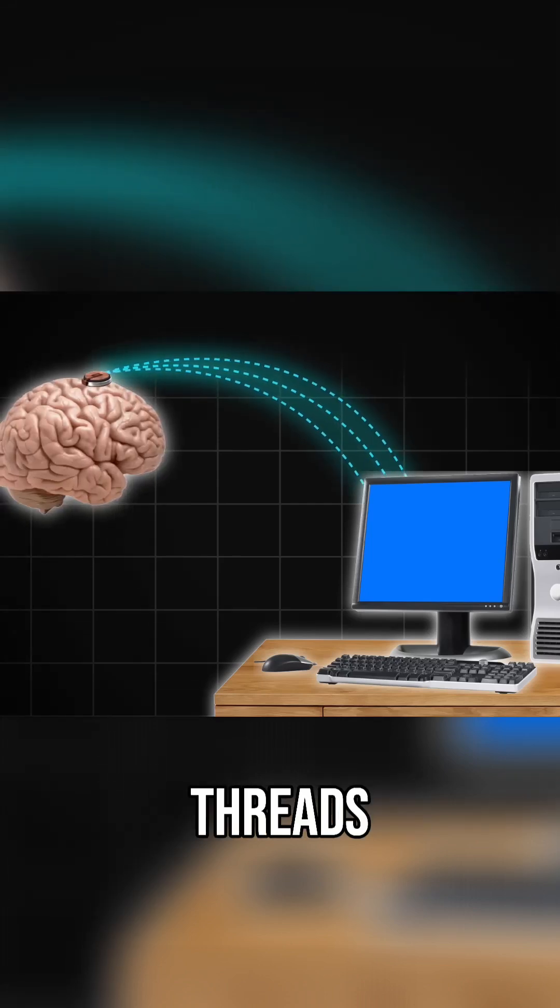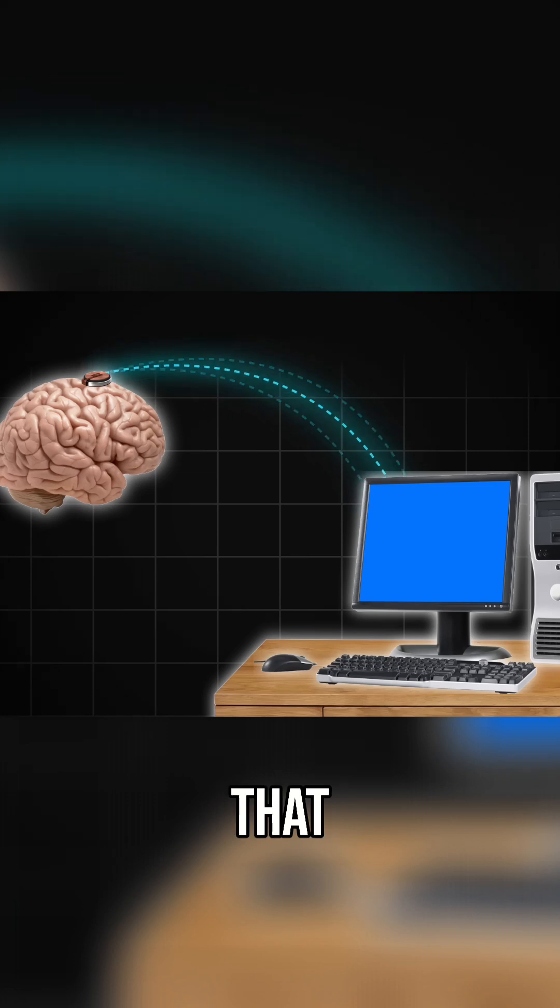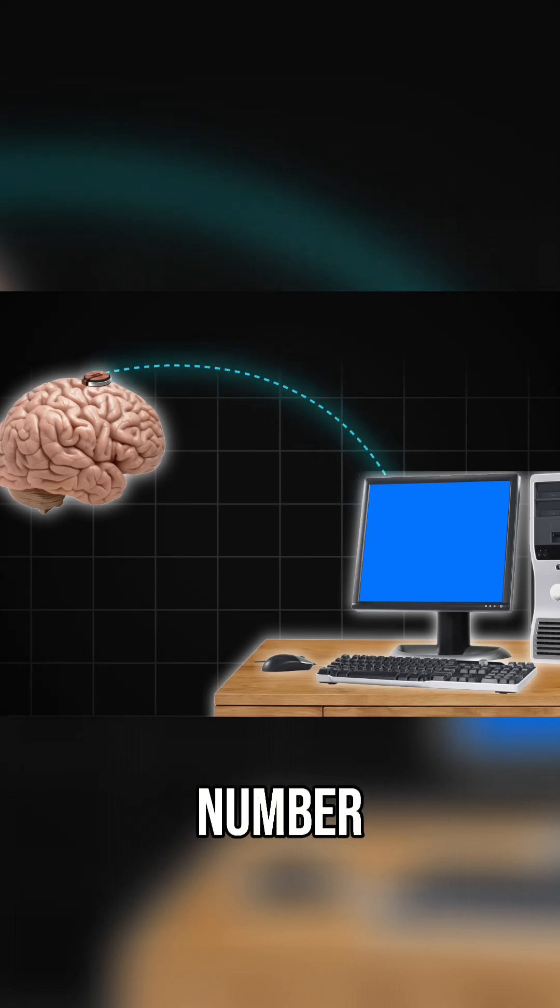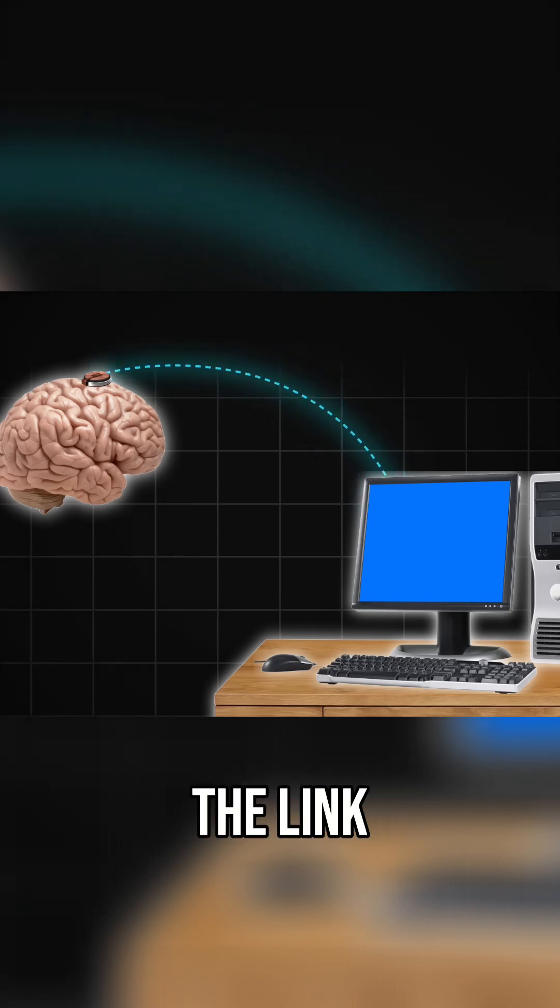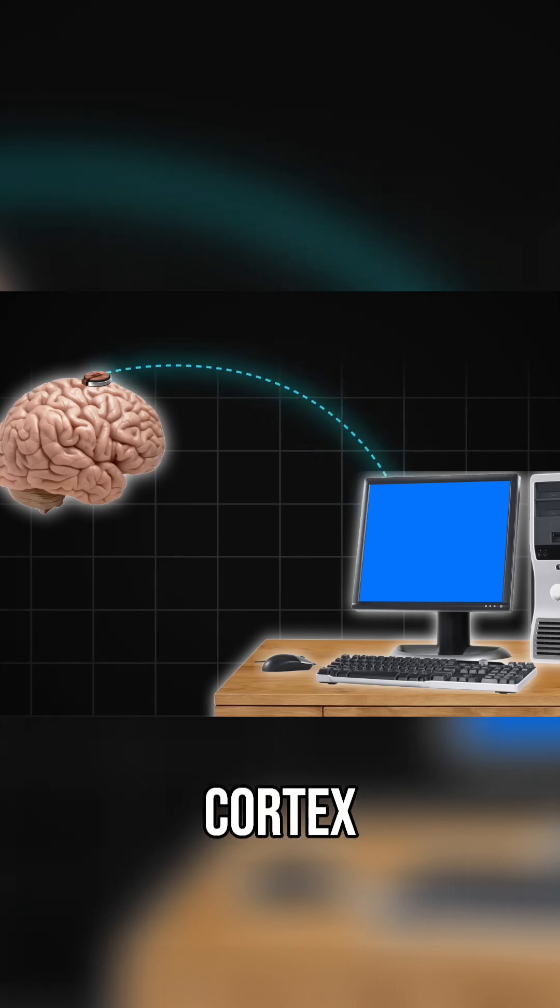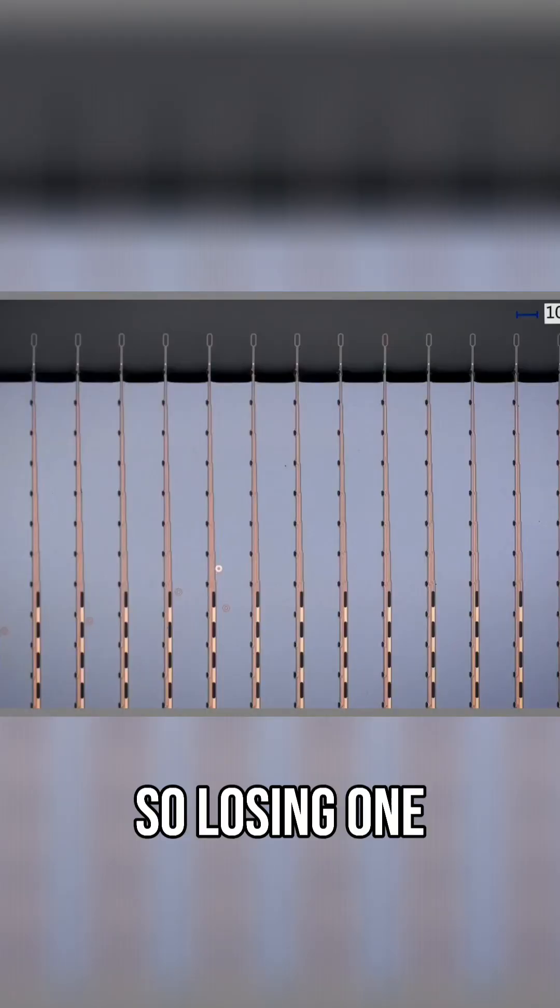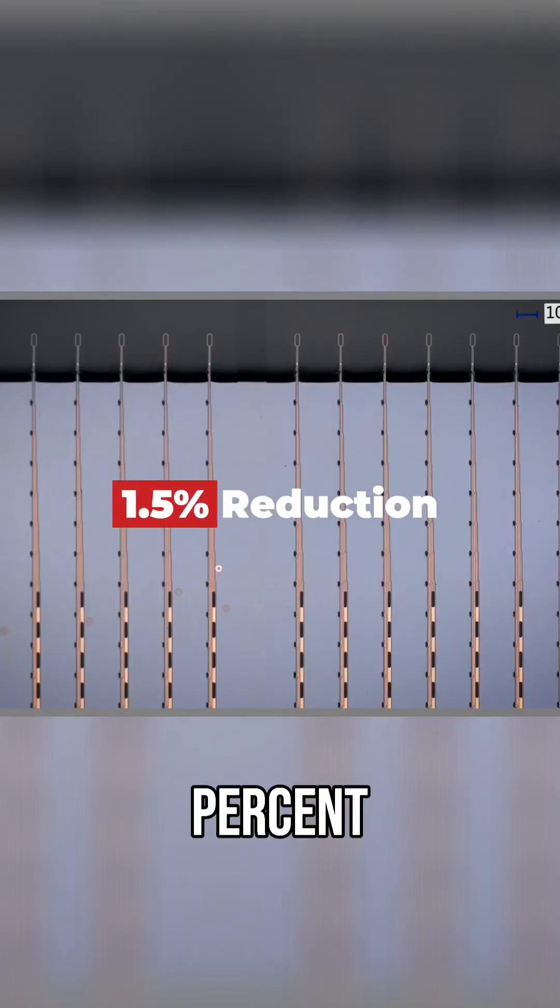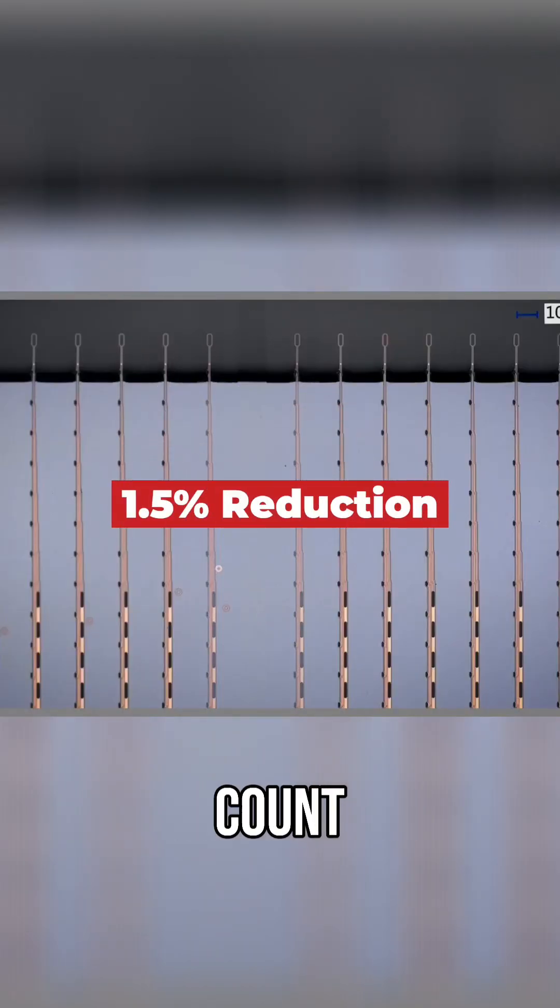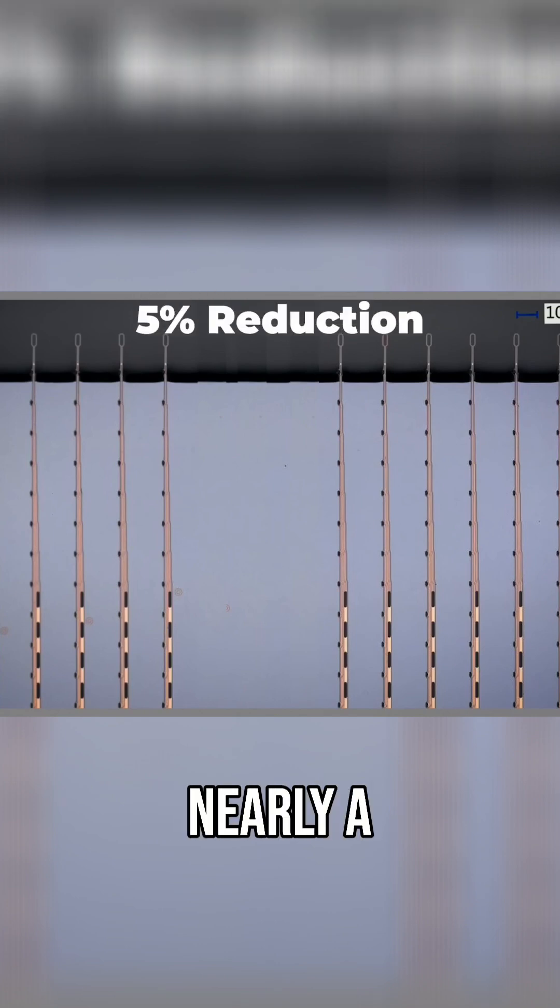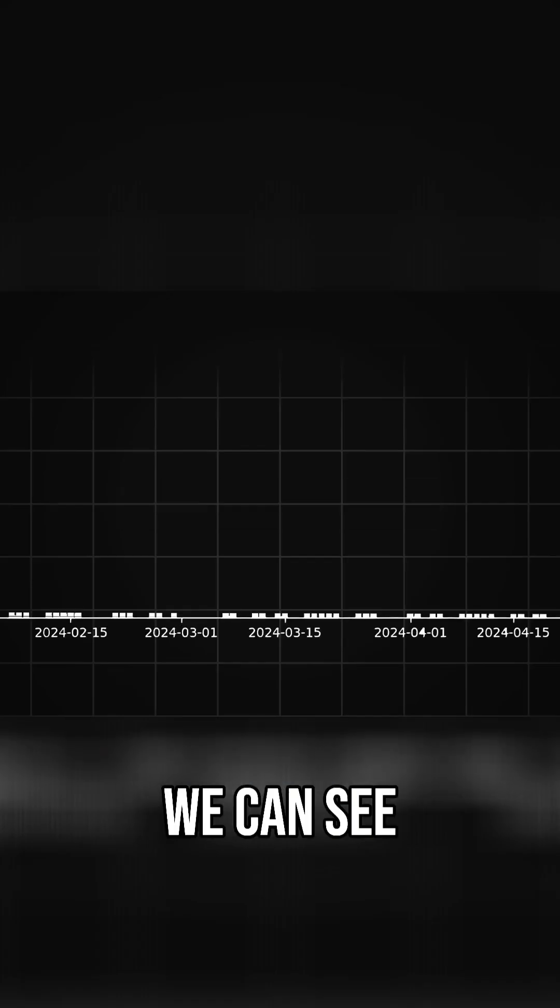So when the threads retracted from the brain, that decreased the number of electrode interfaces between the link implant and the motor cortex. So losing one thread would be a 1.5% reduction in electrode count. Losing just three threads would be nearly a 5% reduction in brain connection.